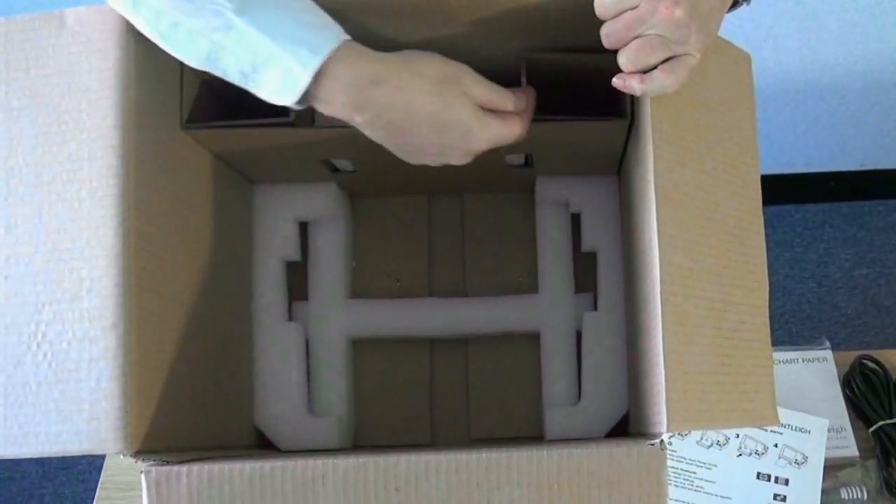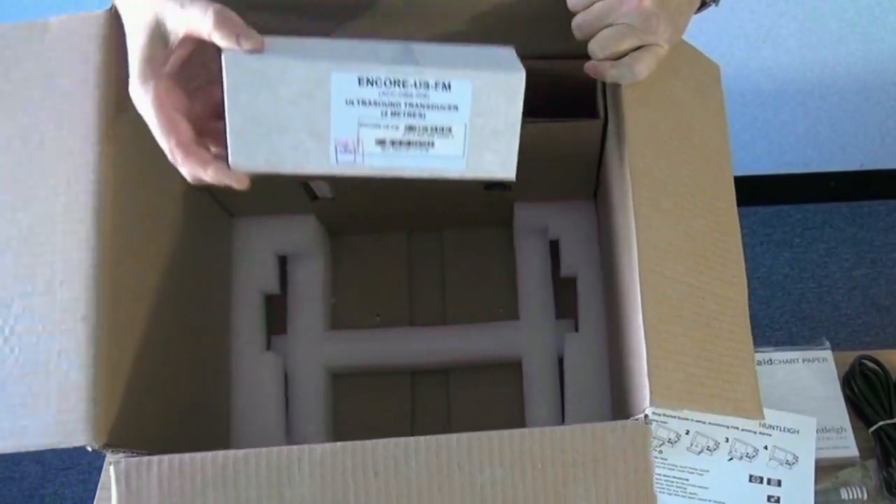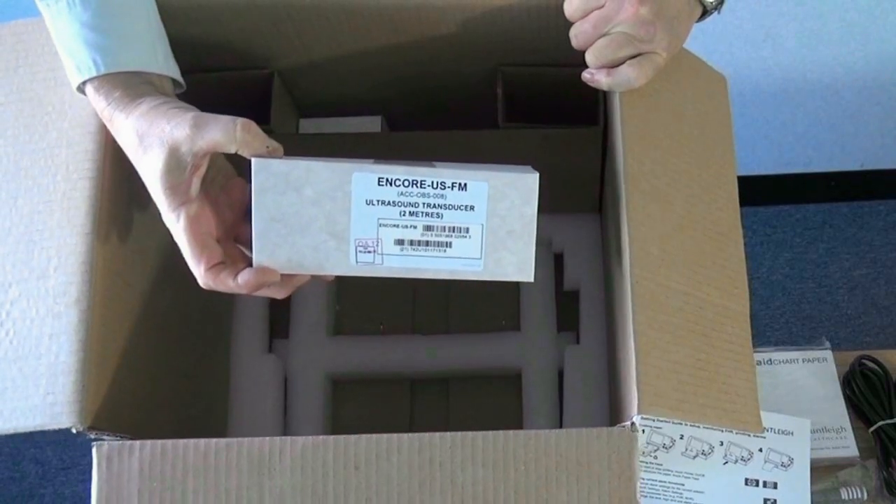Note that in addition to the Accessories box, depending on options, some transducers may be stored in the side of the main packing box, as shown.